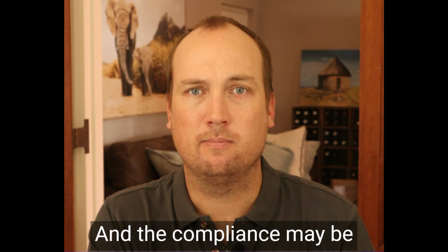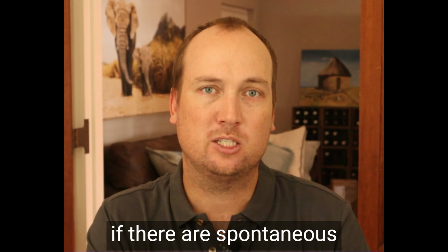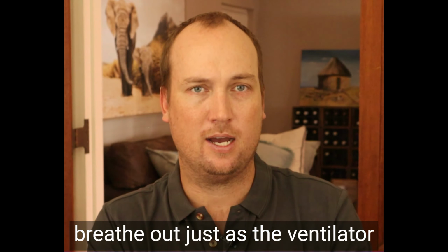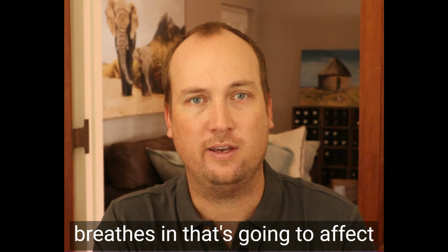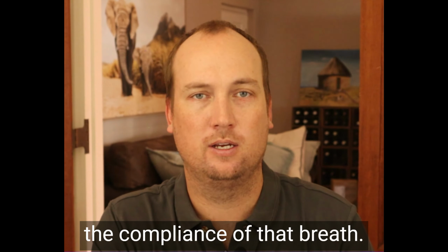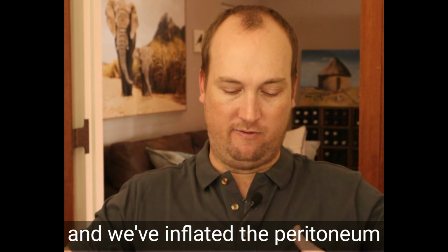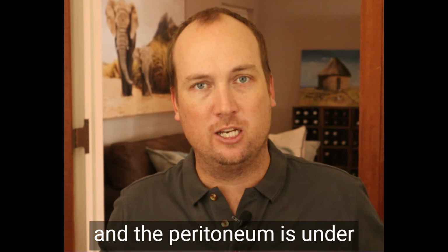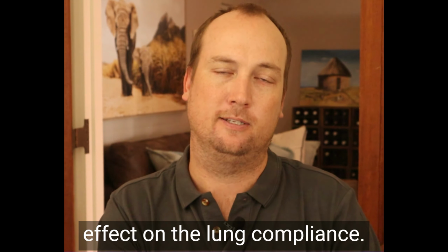And the compliance may be affected by numerous things. If there are spontaneous breathing efforts of the patient, so the patient is actually trying to breathe out just as the ventilator breathes in, that's going to affect the compliance of that breath. If one is performing laparoscopic surgery and we've inflated the peritoneum with lots of carbon dioxide and the peritoneum is under pressure, that's going to have an effect on the lung compliance.